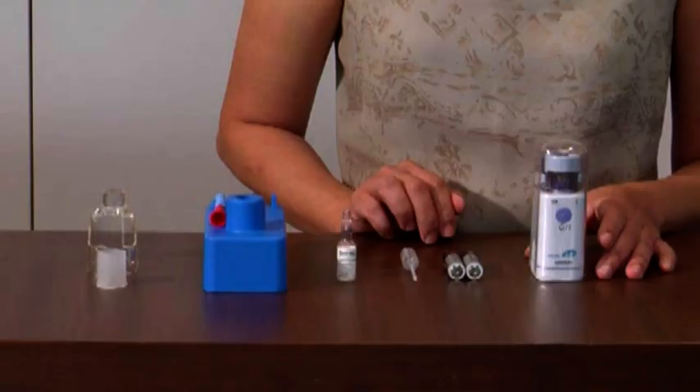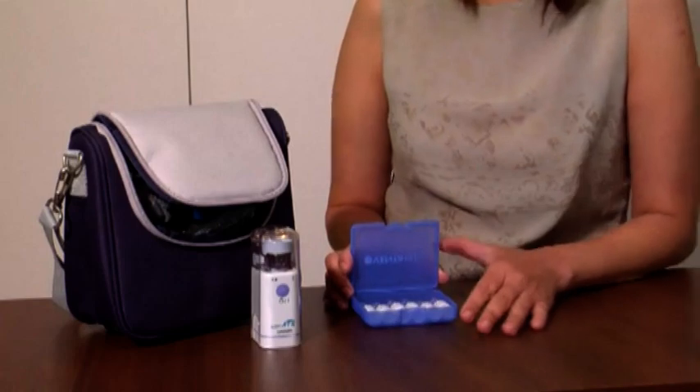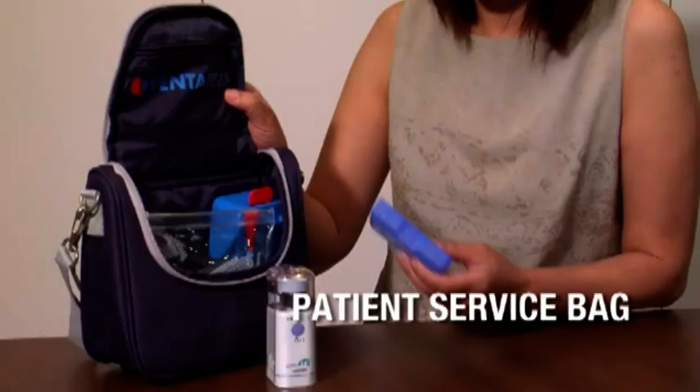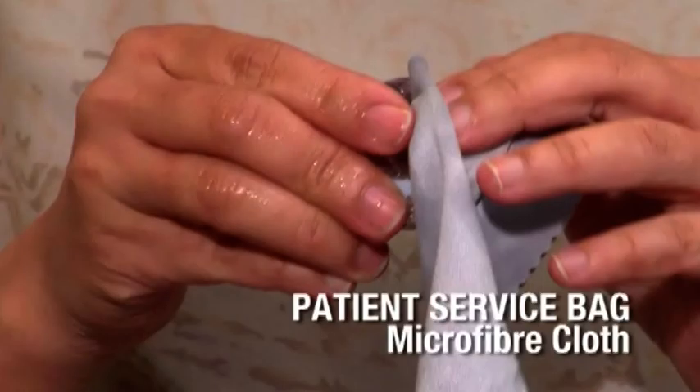If you feel that the Ventavis effect is too strong or too weak, talk to your doctor. When you are started on Ventavis, you will get your medication from the hospital or pharmacy. Bayer Schering Pharma will ensure that you also get a complete nebulizer set. The patient service bag contains the necessary additional items, including: medication Ventavis ampoules, nebulizer main unit and mesh cap, mouthpiece, ampoule opening station, pipettes, ampoule carrying plastic box, and a microfiber cloth.